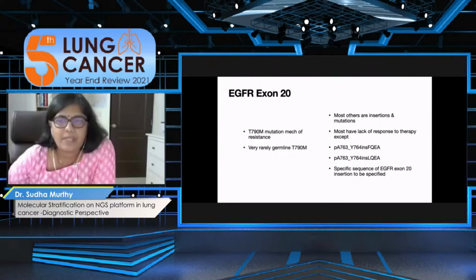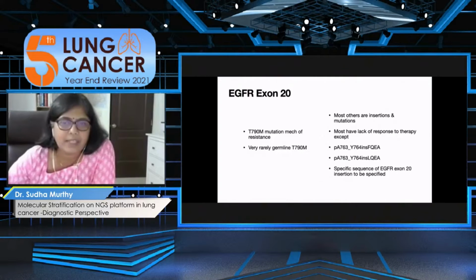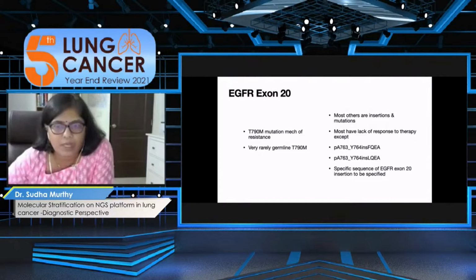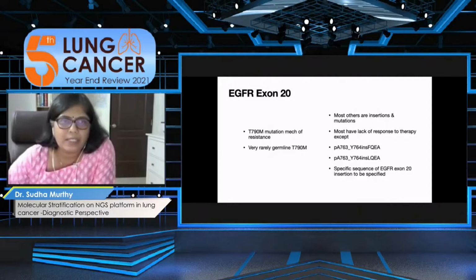Just to say that the specific sequence of EGFR exon 20 insertion needs to be specified. Many labs just do the sequencing and say that insertion is positive, the sequence is not given, but that is very important because most have a lack of response to therapy except the FQEA and LQEA. So it's important to identify the sequence of EGFR exon 20 insertion.